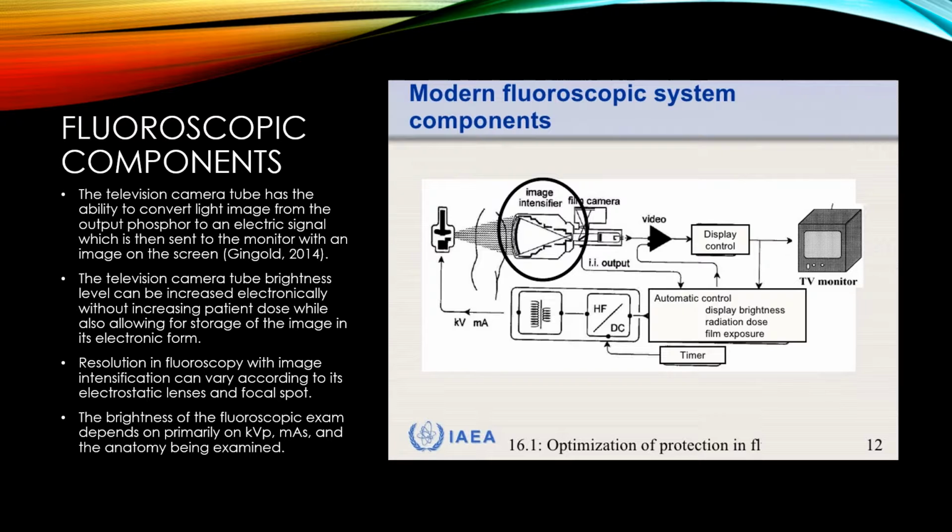When an image intensifier receives X-rays at the input phosphor, visible light is emitted at the output phosphor. The image intensifier brightness gain increases with increasing flux gain. The input phosphor of image intensifiers is cesium iodide, while the output phosphor is zinc cadmium sulfide.